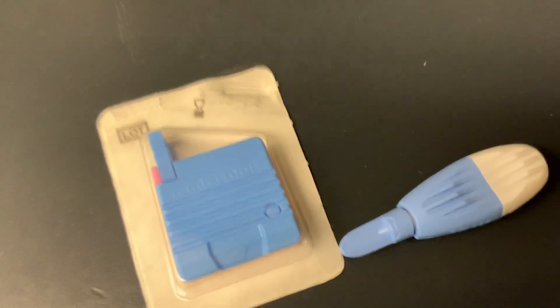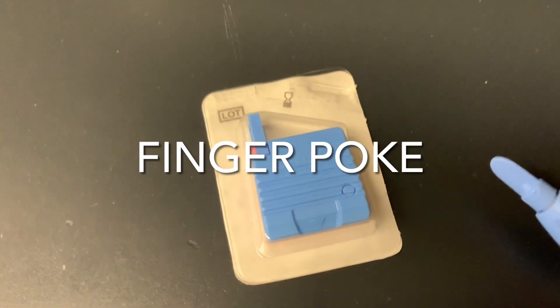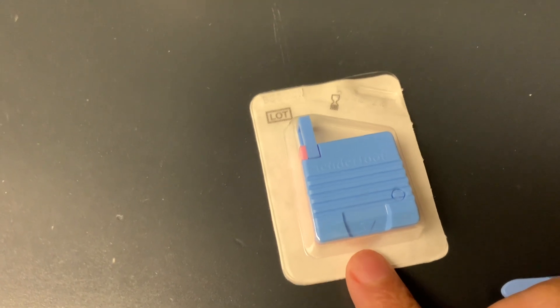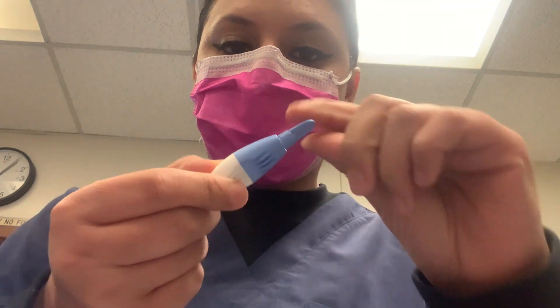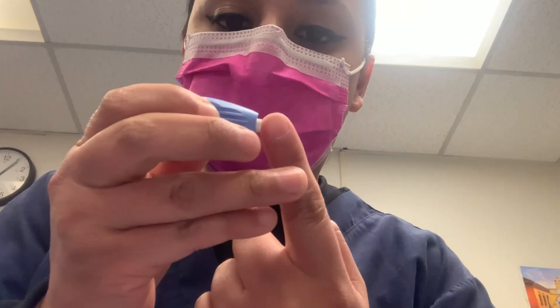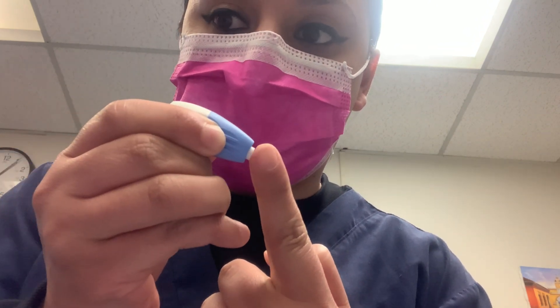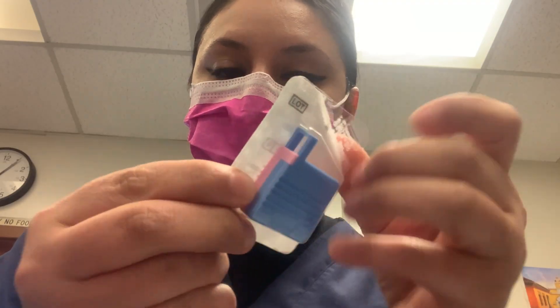I use a warmer to activate the site — just apply it where you want to poke. You could use this device for a finger poke or this one for a heel stick on babies. The trick to get a good blood flow is pressure — don't be scared, do it with pressure. I know it's scary, but this is for the babies.